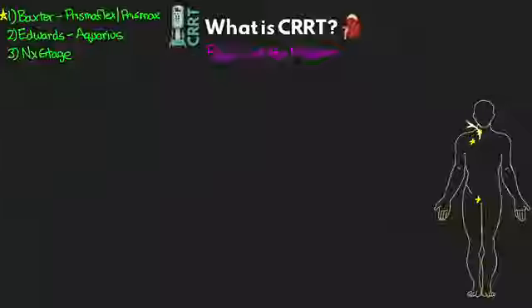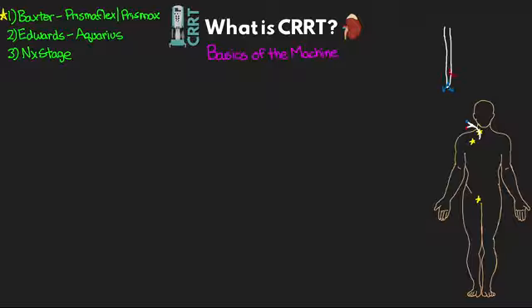And so for this catheter, we really want to make sure that we're using the proper ports that are going to our circuit. To help better illustrate this, let me draw a quick example of what the catheter is like internally. What happens is the return lumen exits at the distal part of the catheter, and then the access line is going to draw from more proximal ports. The reason for this is that we're trying to minimize drawing any already filtered blood back into the system, which would reduce the efficiency of what our run is able to do.